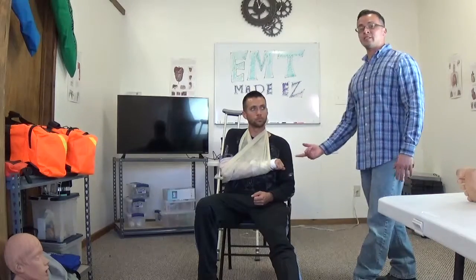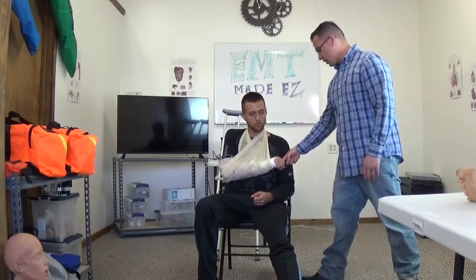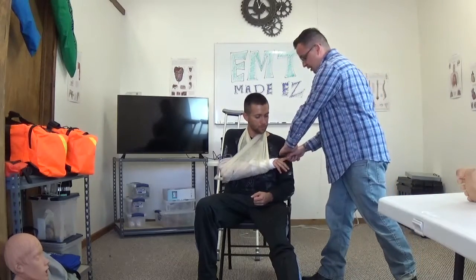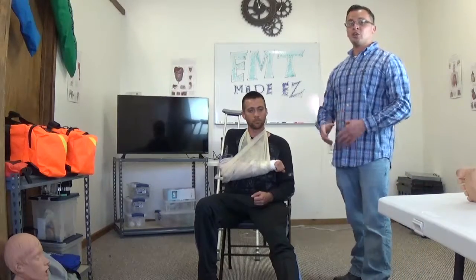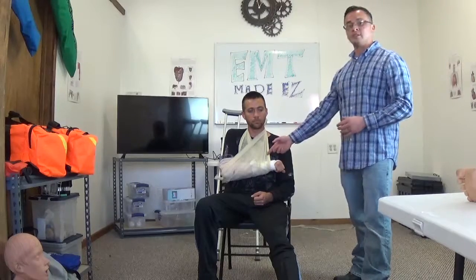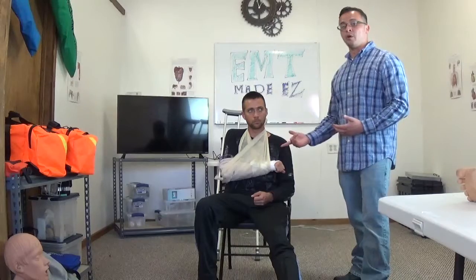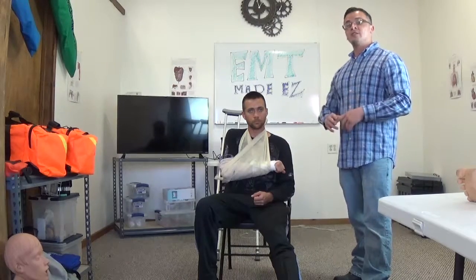The very last thing we do is check for CMS again. I'm checking for a pulse — go ahead and squeeze my finger, let go. Which finger am I touching? The index finger. The reason you do this is to make sure you did not compromise any circulation by putting on the splint, the sling, or the swath.